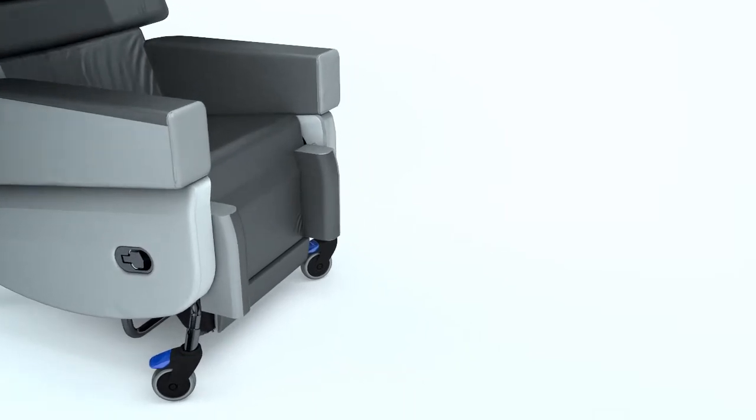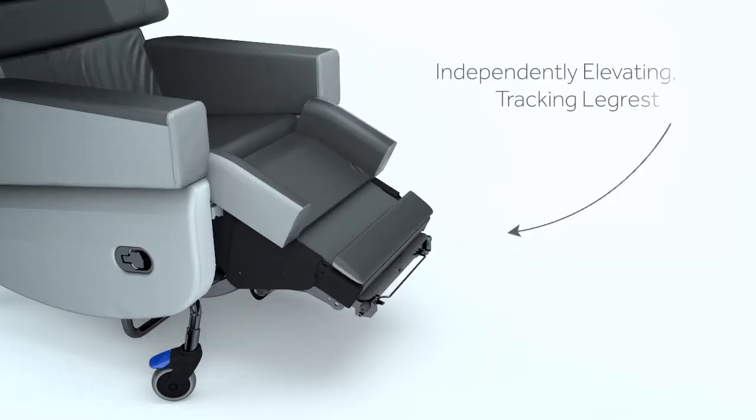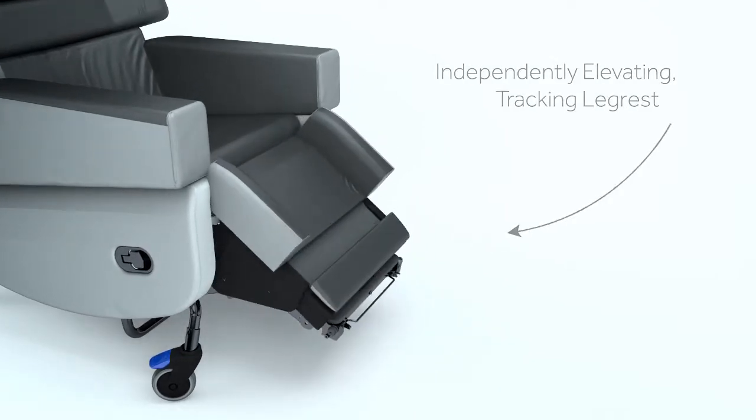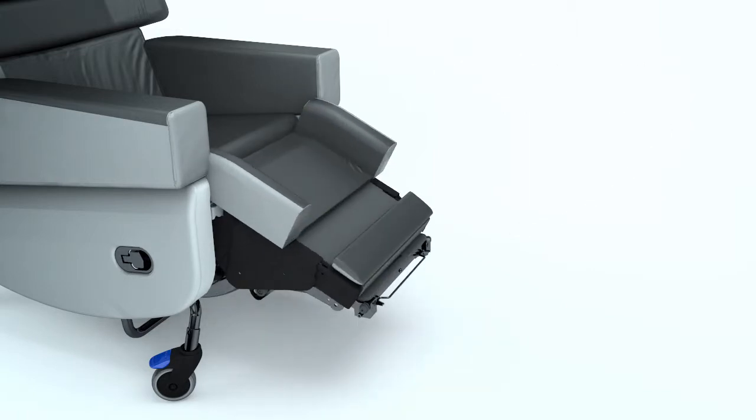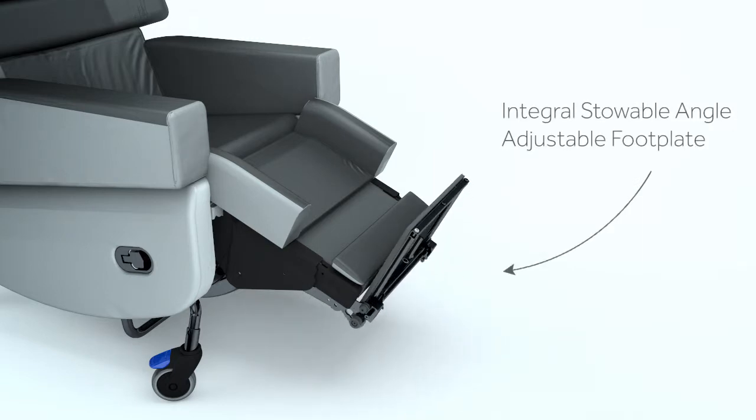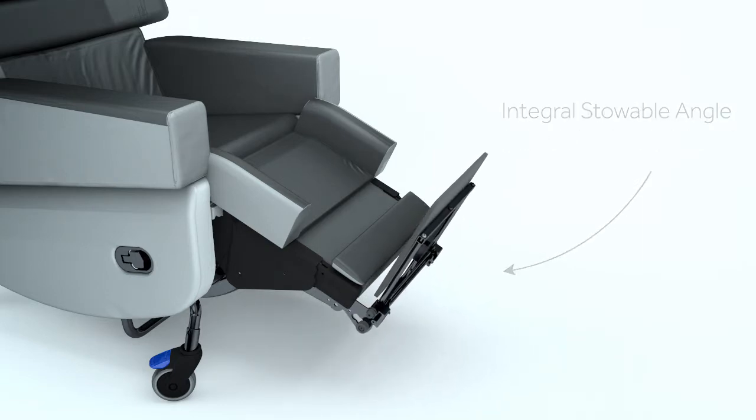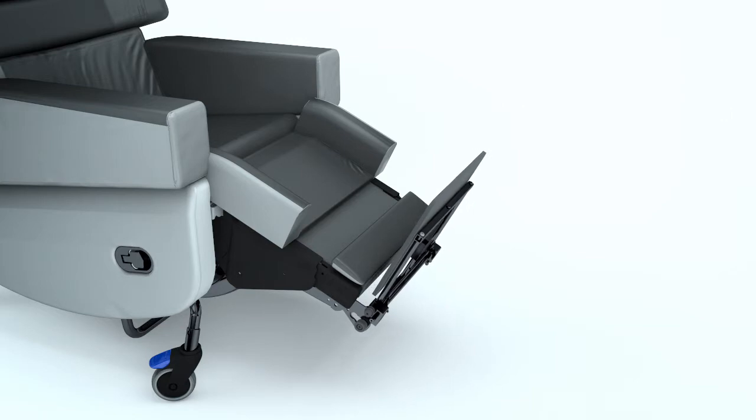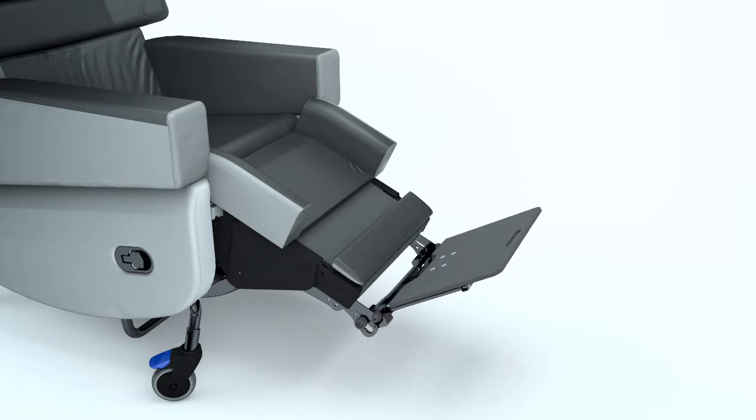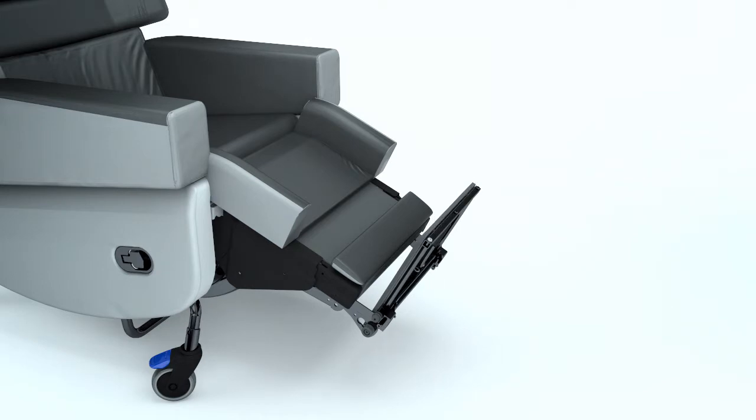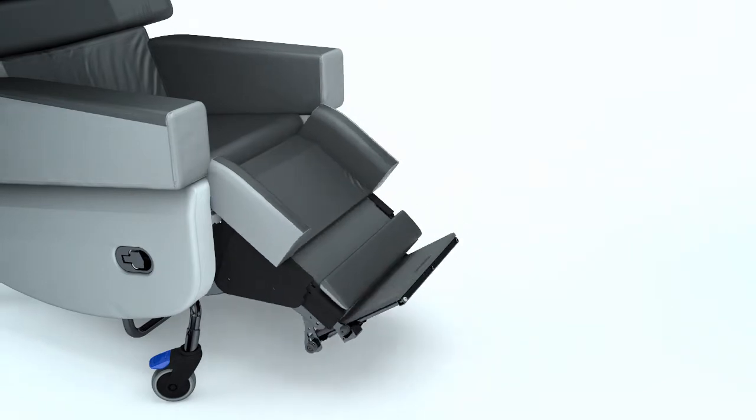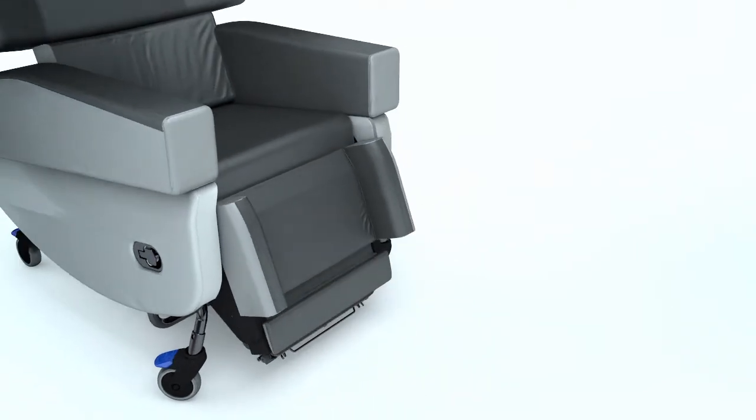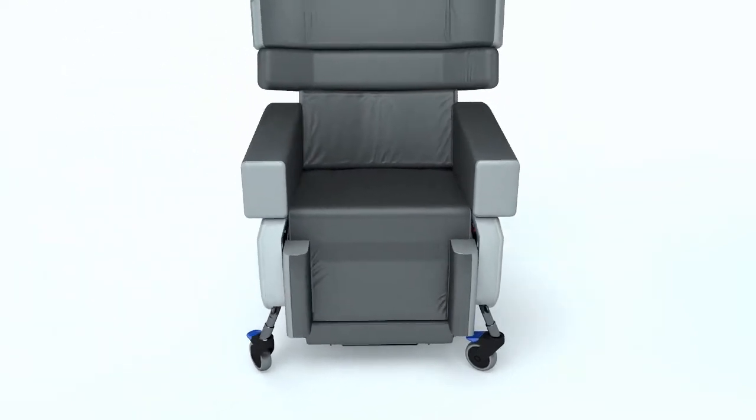The legrest smoothly follows the biomechanical movement of the lower legs as they pivot at the knee joint, giving uniform support to the lower legs and knee whilst preventing drag to the skin. The integral foot plate can be deployed at any point in the range of motion and be extended to accommodate larger feet. The angle can be adjusted for maximum comfort when the user's legs are elevated. It stows away neatly behind the legrest.